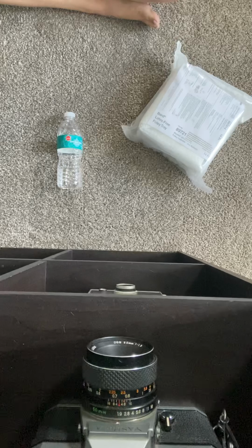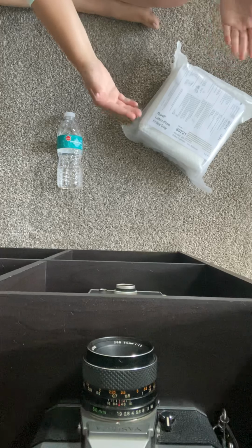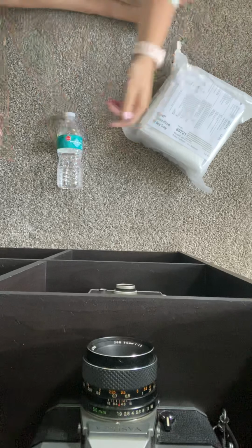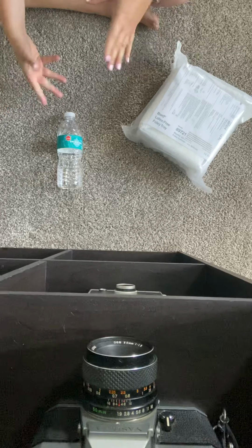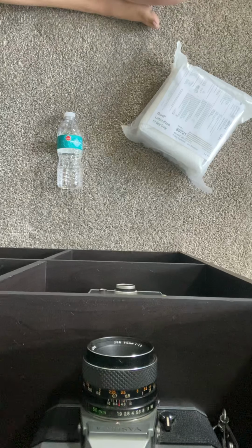So what I like to do is raise my bed up to appropriate height. And then if I'm using a bedside table, it doesn't really matter for now, because you're gonna move this tray closer to the patient anyway. But if you did have a bedside table, just to start, it would be nice to raise that to level as well.